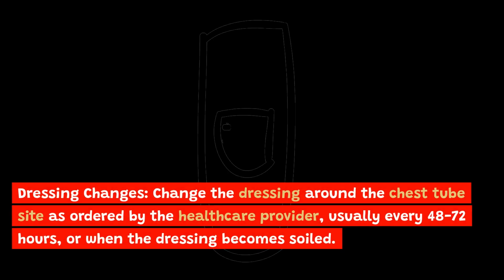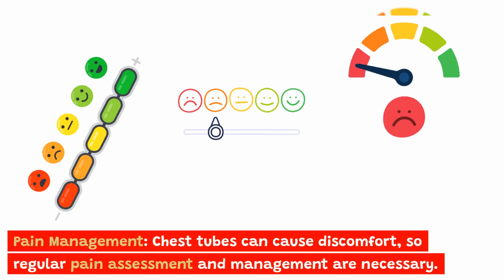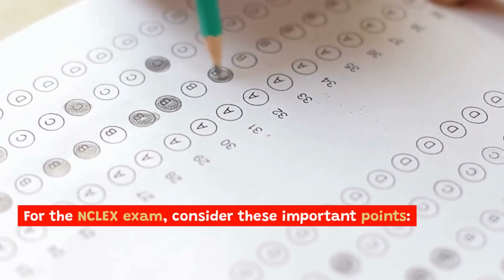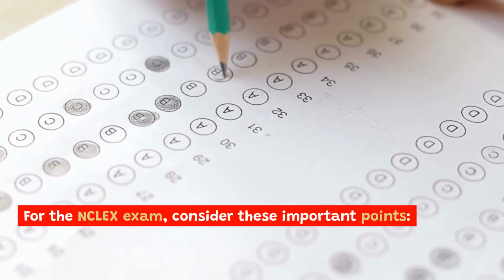Dressing changes. Change the dressing around the chest tube site as ordered by the healthcare provider, usually every 48-72 hours, or when the dressing becomes soiled. Pain management. Chest tubes can cause discomfort, so regular pain assessment and management are necessary. For the NCLEX exam, consider these important points.